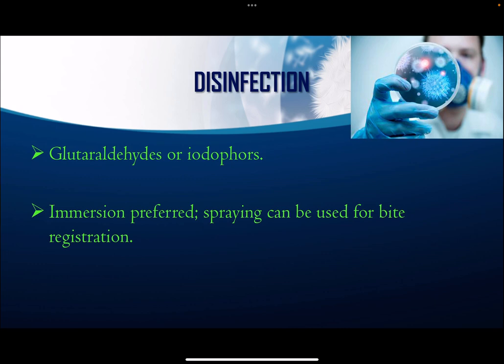Disinfection of the impression is via glutaraldehydes or iodophores. Immersion in these disinfectants is preferred. Spraying can be used for bite registration.